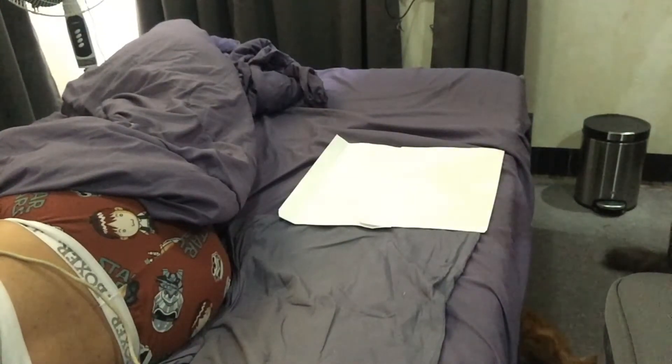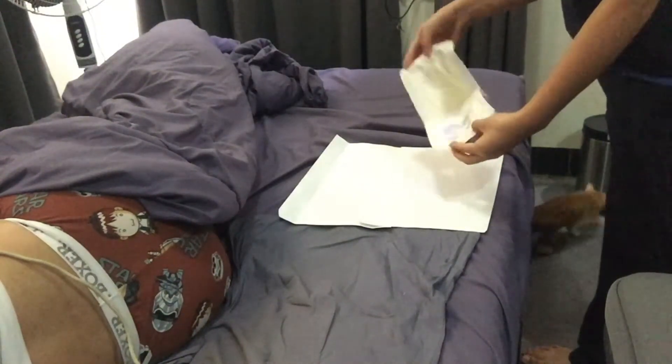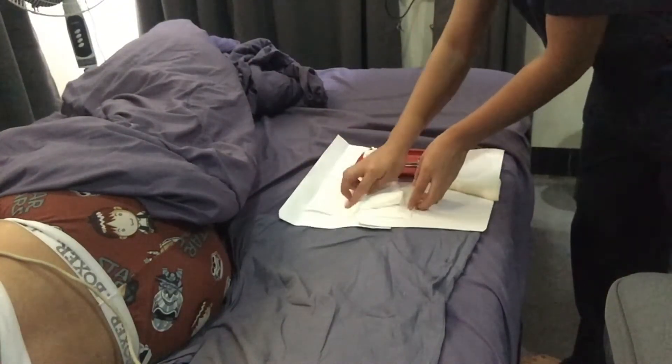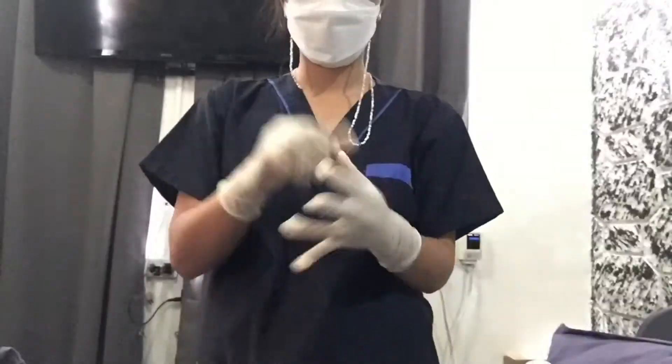Set up the sterile field and open the sterile Xeroform petrolatum dressing and place it on the sterile field. Always remember to maintain sterile technique throughout the procedure. After that, perform sterile gloving.